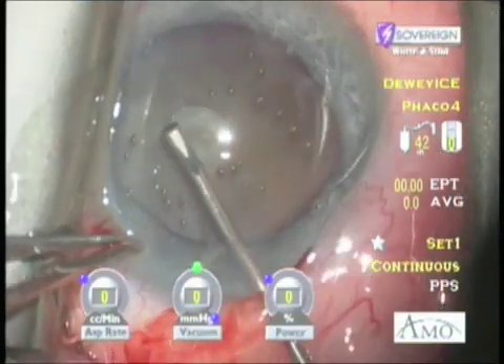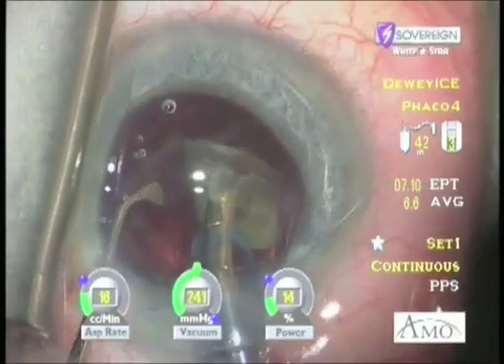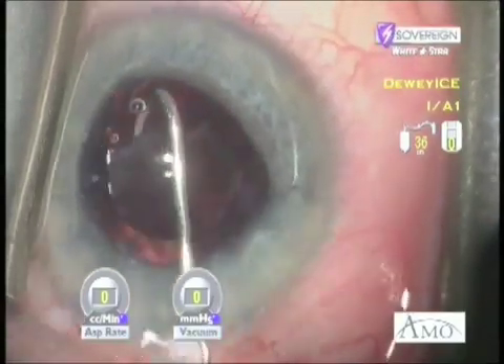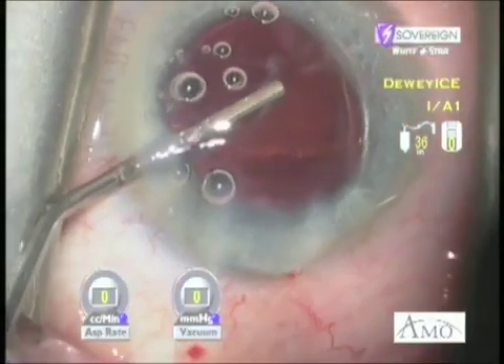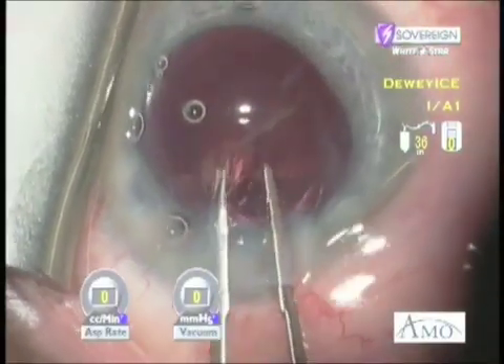As if this patient's hard motion cataract wasn't bad enough, he also had an impressive plaque on the posterior capsule. We did get lucky, and while removing cortex with J-cannula irrigation, I found a plane of cleavage between the plaque and the capsule. This plane was expanded with cohesive viscoelastic, and the plaque was peeled, but only with significant tangential forces on the zonules. We did successfully avoid a YAG capsulotomy, at least for now.